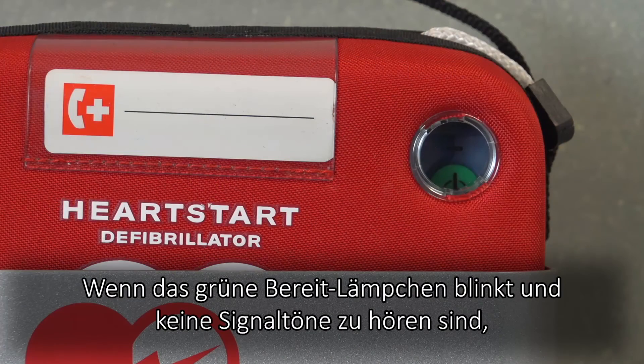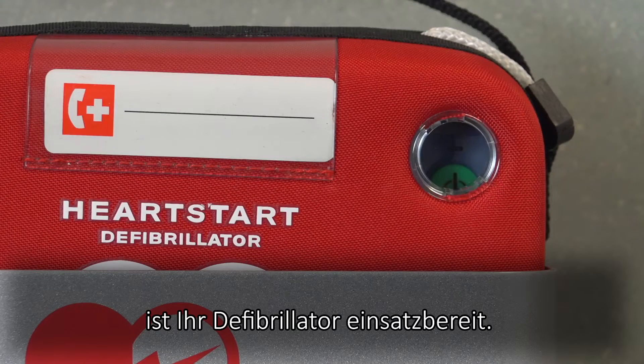When the green ready light is flashing and the device emits no chirps, the device is ready for use.